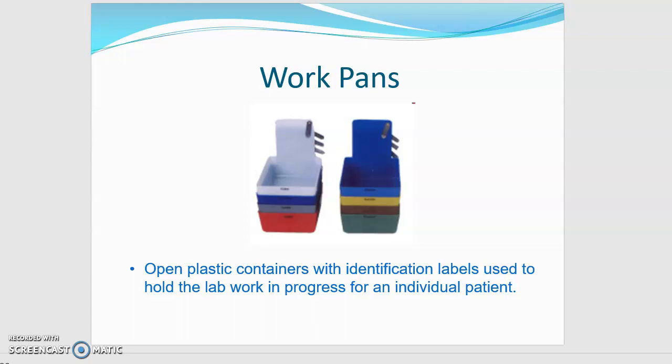Once that's all taken care of, then the doctor would remove all items from the pan once the procedure is complete and dispose of it as needed. The little metal clip holds the lab slip on it, or maybe a note with the patient's name and whatever it is that's being done on that patient.